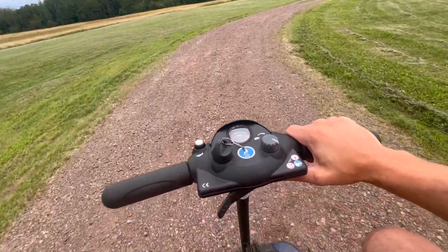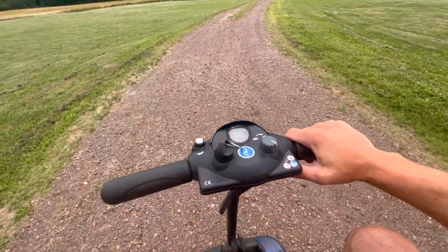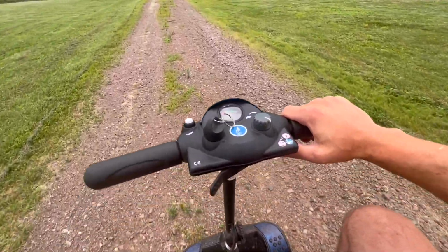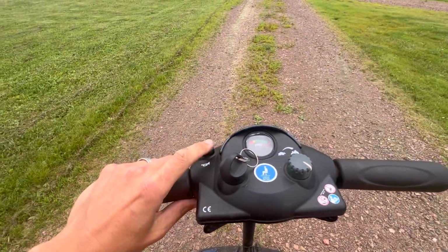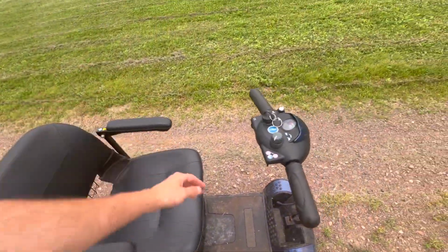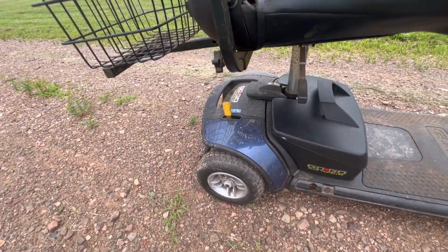It's a little bumpy. I got this thing maxed out on speed too. So that's it. I suppose you don't really need to go much faster. It definitely cruises a little bit quicker on concrete or a flat surface, but it works. So, I think all we have left to do is just cosmetic stuff. I cleaned up the seat and stuff before I sat down, but you can see there's a whole lot. I'm just gonna clean this up. But it runs, it drives.